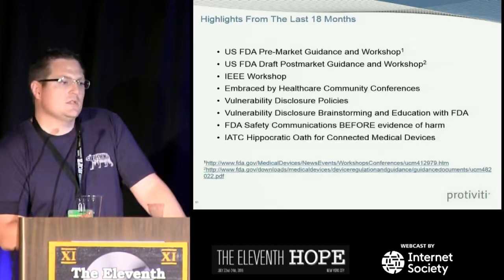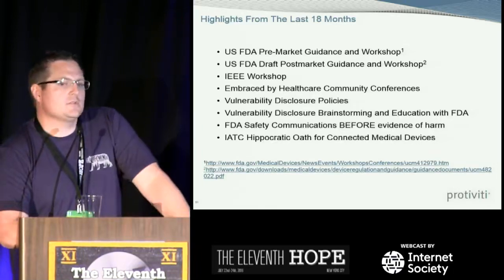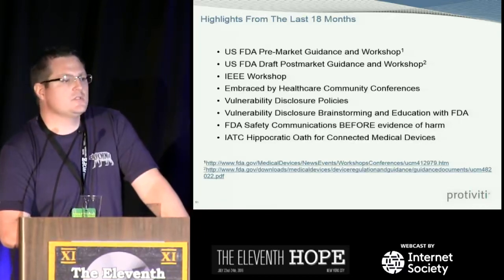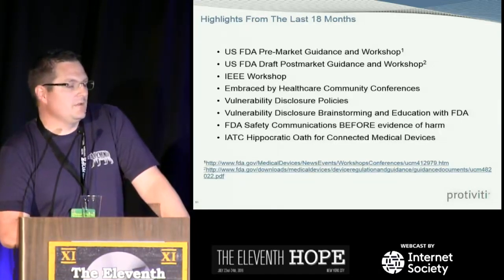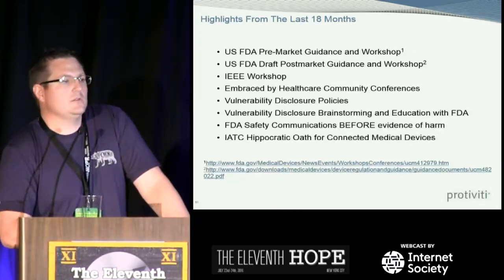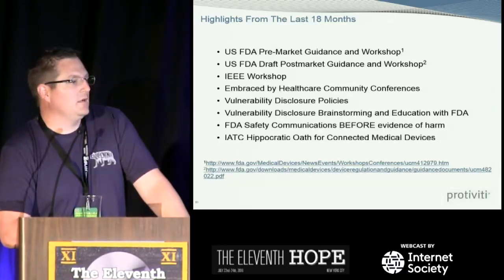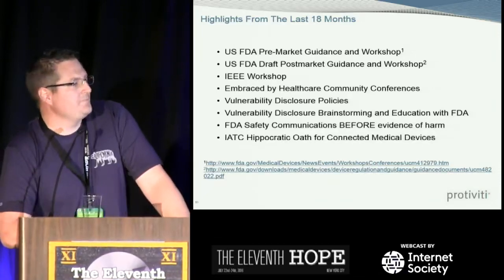Vulnerability disclosure policies. Two years ago, we didn't have a single device manufacturer that had a coordinated vulnerability disclosure program. And now, two years ago at DEF CON, Philips Healthcare was the first one to announce that they were going to do it, and they finished it at the end of that year. And so they were the first healthcare organization to implement coordinated vulnerability disclosure, and now there's more. So now Draeger has done it, and they announced it at B-Sides last year. And Medtronic has a dedicated website. GE has a dedicated reporting method. So it's getting better, and now it's in the FDA guidance.